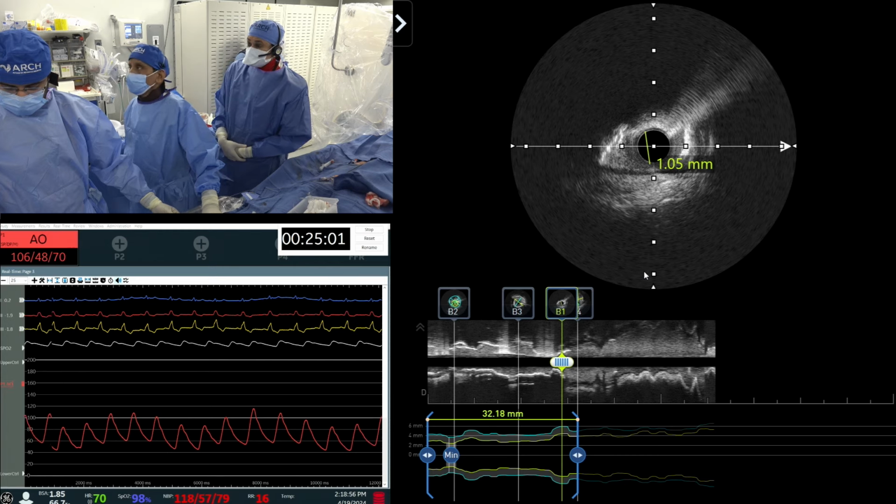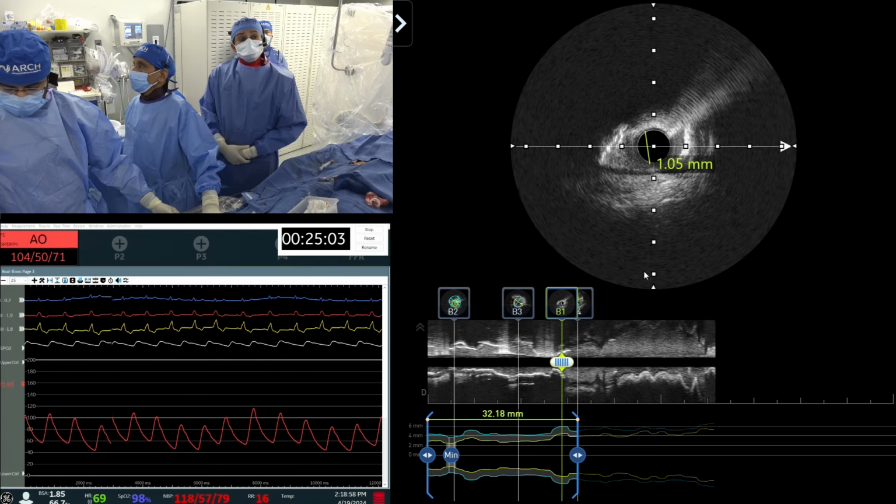How about lithotripsy? It won't go. Remember, it did not go through and through. We'll show the angiogram now. So no, we'll use lithotripsy, but as an adjunct.